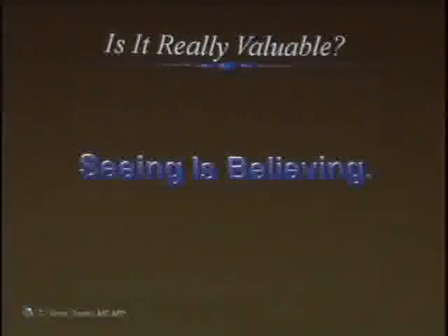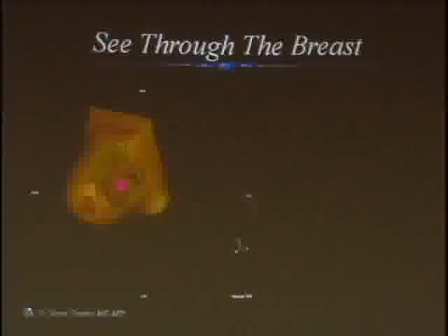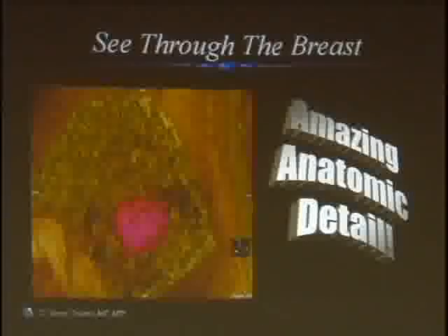But seeing is believing. I can say this to you all day long, but it doesn't help. As soon as I show you this, you're going to understand why. This is what MRI is. It's 3D. You can see right through the breast to the tumor. It has unbelievable detail. The voxels, the little imaging volume that I use for my studies, is less than 1 millimeter in size. And there are millions of them in each breast. So I have resolution that's incredible.